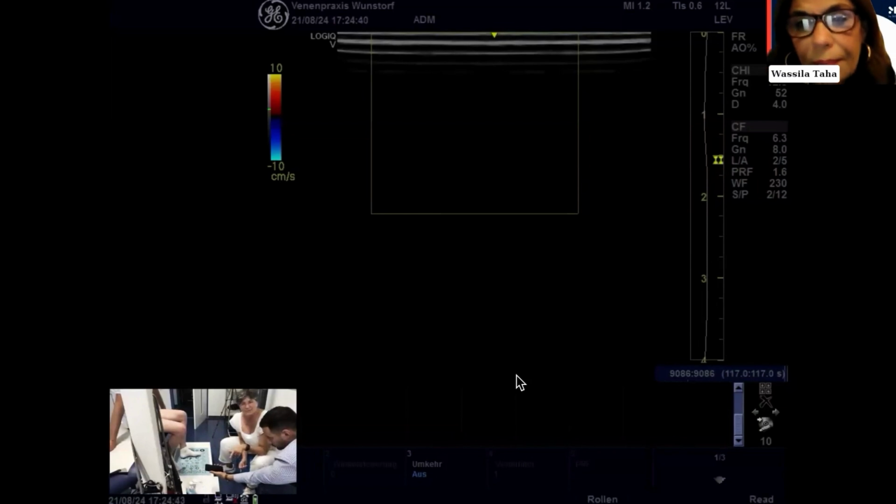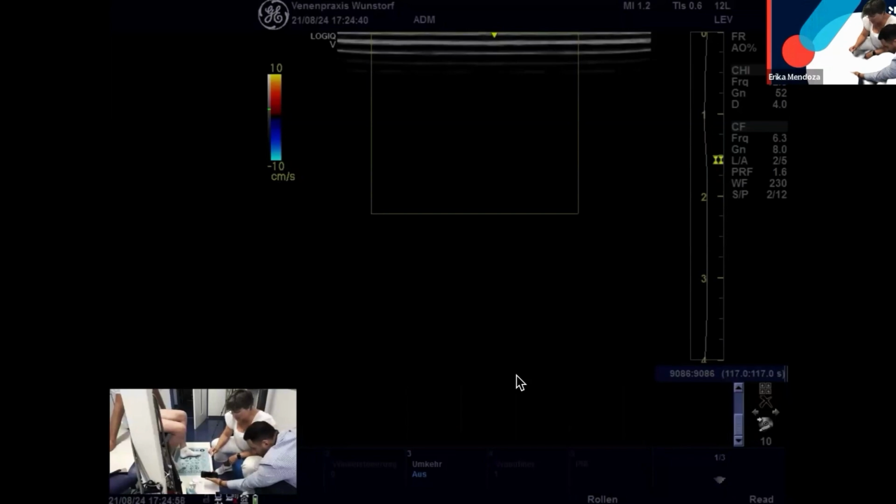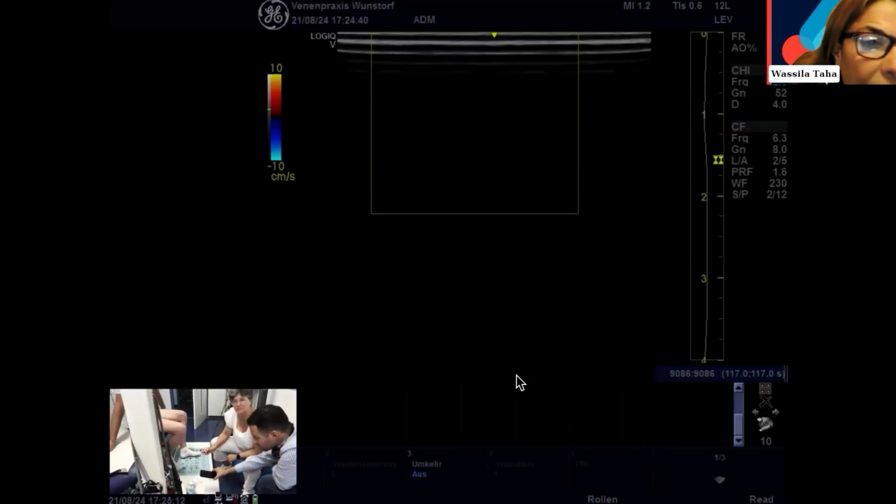Can we put it much more highlighted, because we cannot see the diagram? Instead of the screen of the ultrasound, could we put the schematic diagram on this? It's very interesting what you are saying now, but we cannot see the schematic diagram clearly. Can you please switch the screen for a while? The main image is the ultrasound screen. If we can change it with the diagram, it will be great.